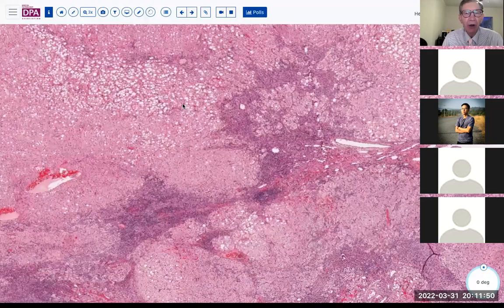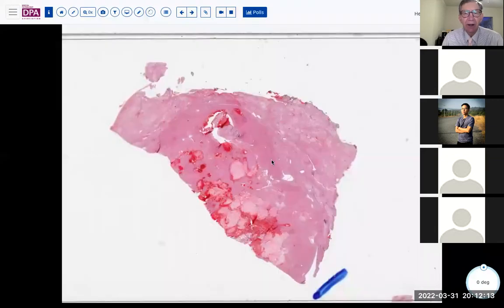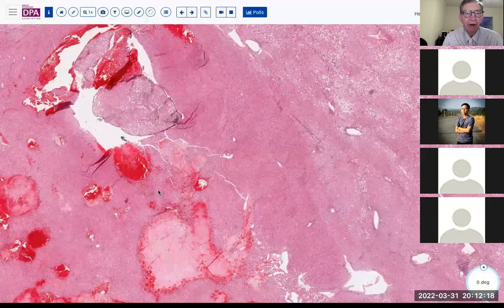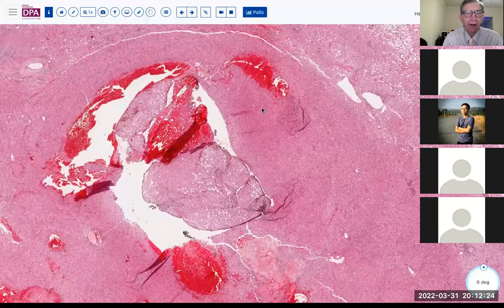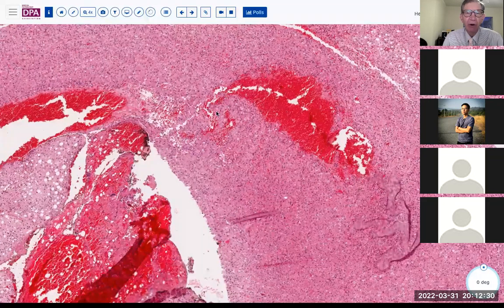Now, in hepatic adenomas, you can sometimes get areas of fatty change, sometimes just in the adenoma. That will be a hallmark feature, and sometimes not. It's not a consistent feature as to whether or not there's a fatty change in the adenoma, but sometimes we've seen that. Here's another example. Obviously, this one is a very vascular one. A lot of hemorrhage and so forth in this.